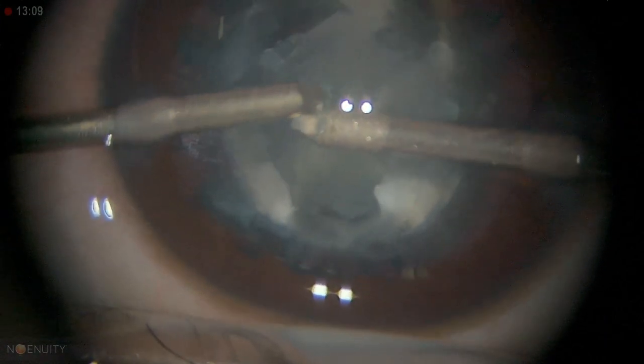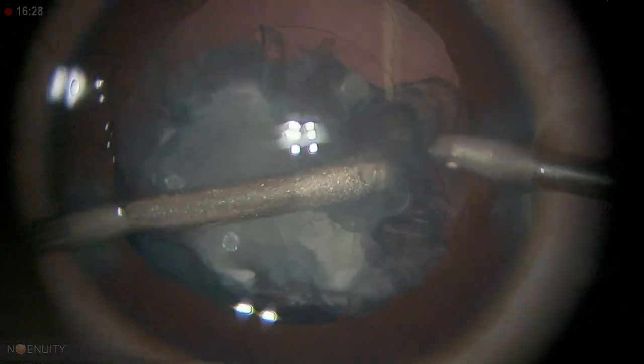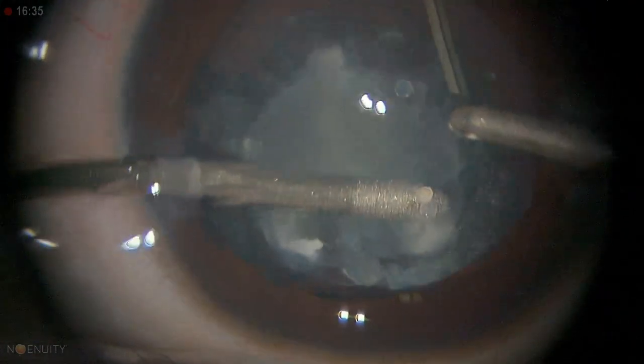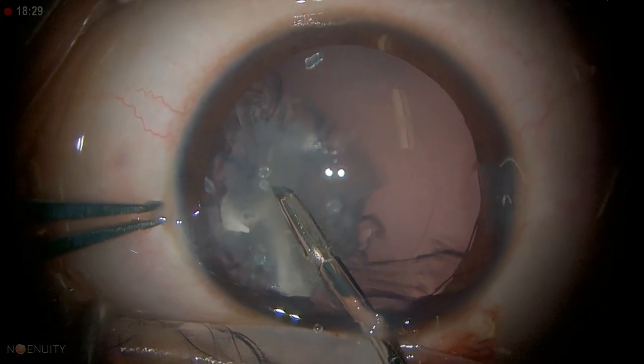I really have to feed it — it's like a small pearl. You can see there are at least six to seven stones in the anterior chamber. This is very unusual; I am seeing this for the first time. If the nucleus is very calcified, I use phaco — in my experience about 10% of pediatric cataract surgeries need some phaco energy. We will remove those pearls and then continue with the vitrectomy. This is a very unusual scenario — pearl picking.